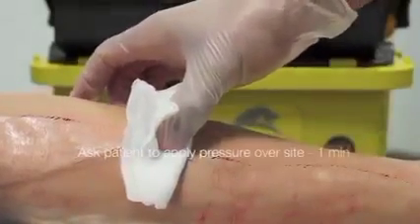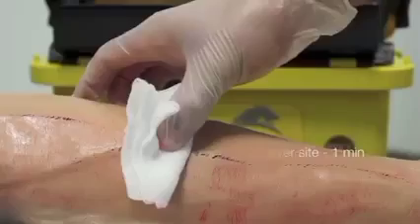Only apply pressure once the needle is out. Then get the patient to hold the cotton wool or gauze in place for a minute after you've taken the needle out, to catch any bleeding.